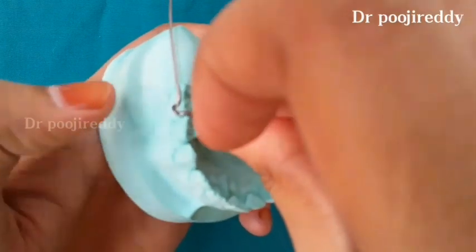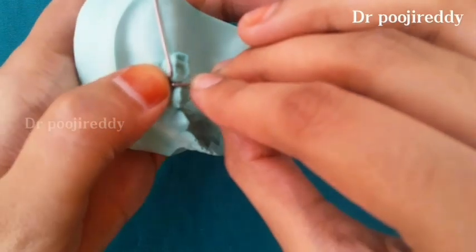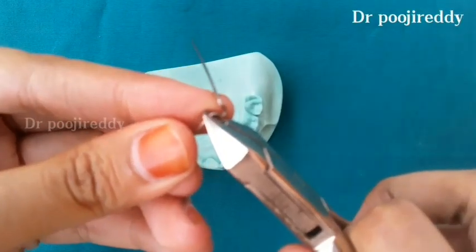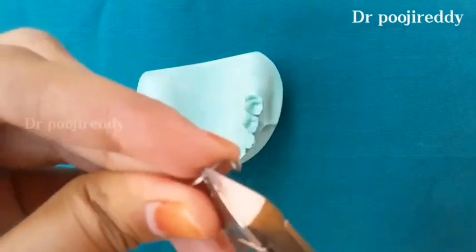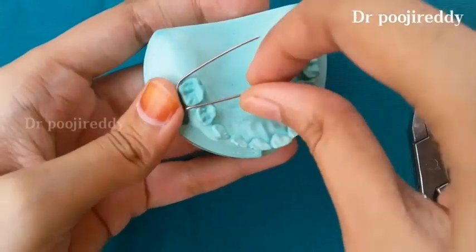This is how it looks like. Place it in the cast. Now just give a slight bend with the beak of the Adams plier so that it will surround around the buccal surface of the molar distally.